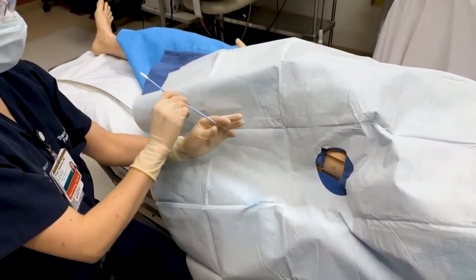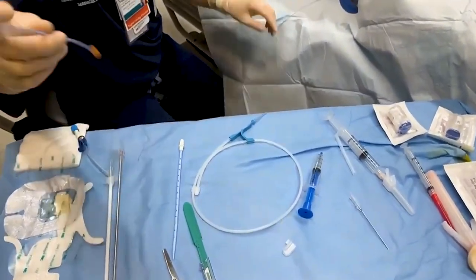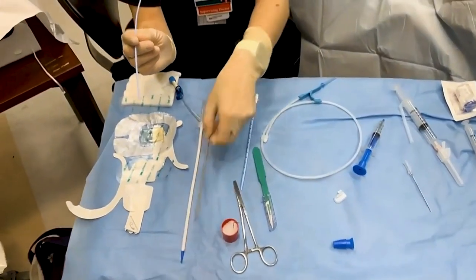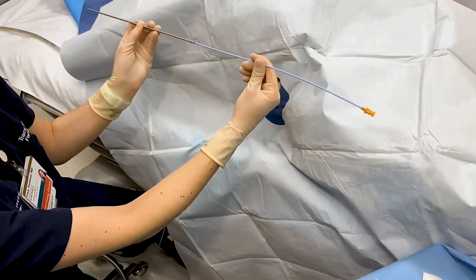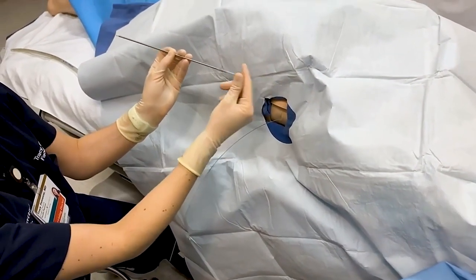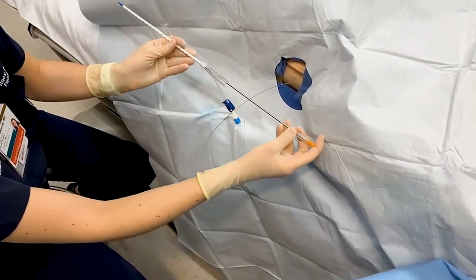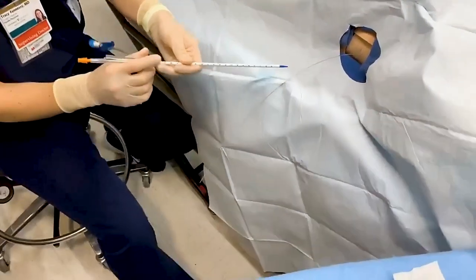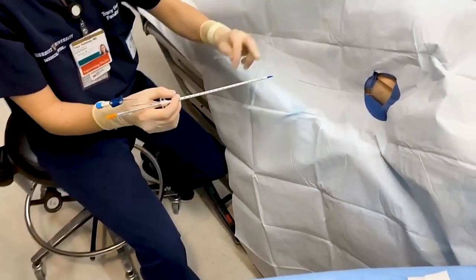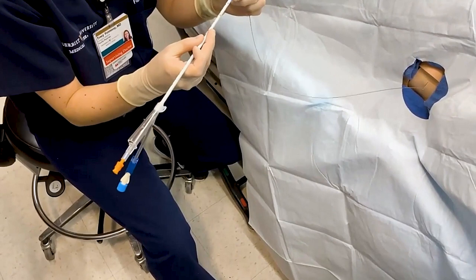Now you'll get your pigtail catheter ready. You have your smaller dilator, which goes into your Trocar. Then go ahead and put the small dilator and the Trocar into your pigtail catheter — this gives stability to your catheter. You'll go ahead and put this over your wire.